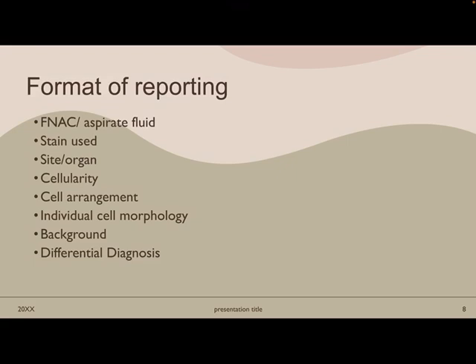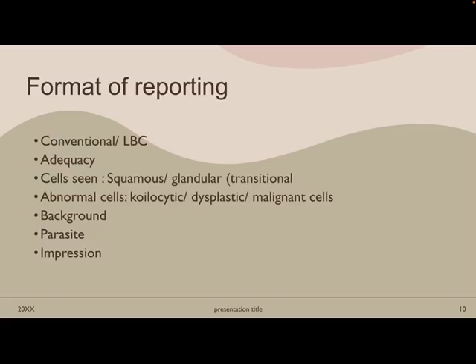Okay, and then coming to pap smear. You can get a conventional pap, which is used in most of the medical colleges, and you can get even a liquid based preparation in good centers. So you have to identify how a conventional pap looks and how a liquid based preparation looks. Study the differences and keep them in mind. And then you have to say how adequate it is, so you have to know the adequacy criteria in conventional and liquid based preparation.